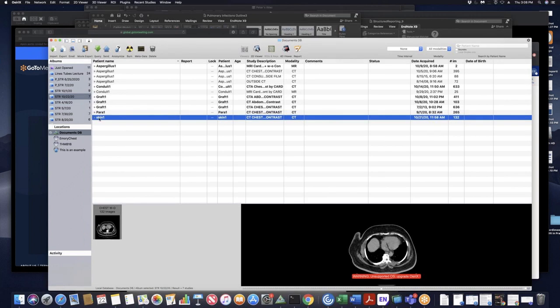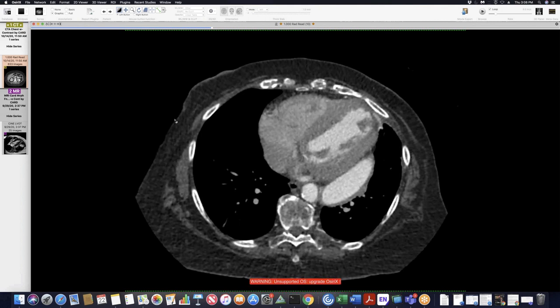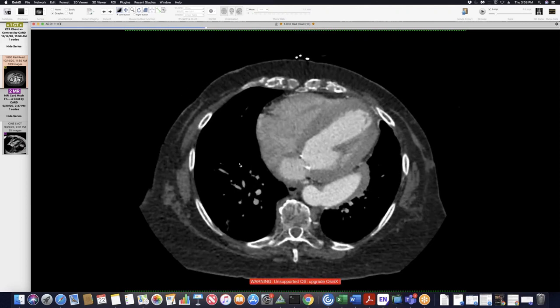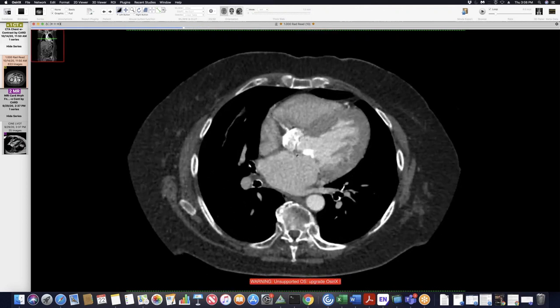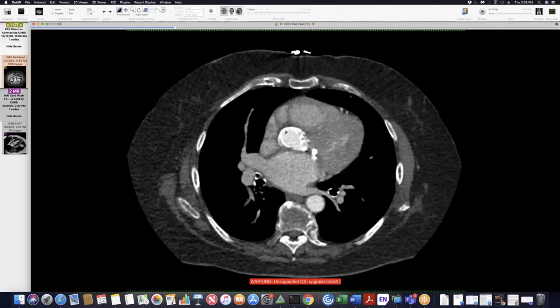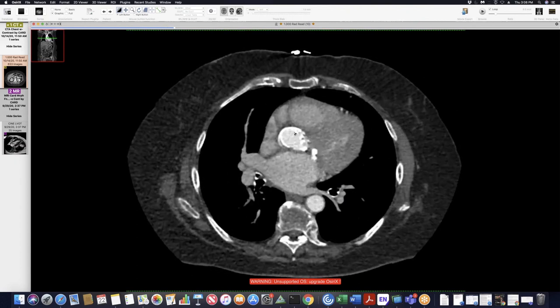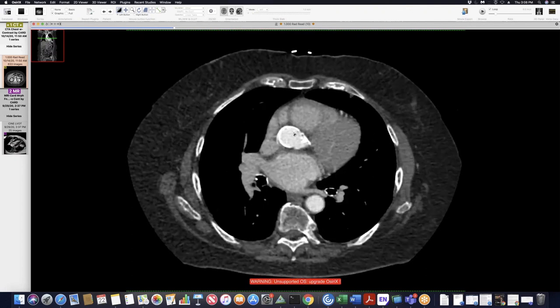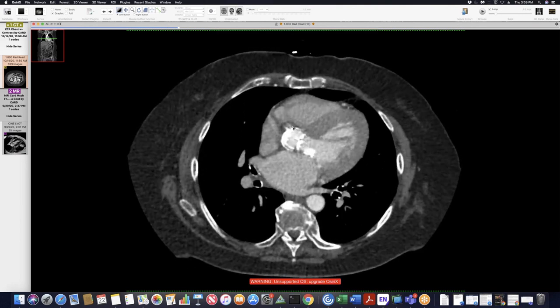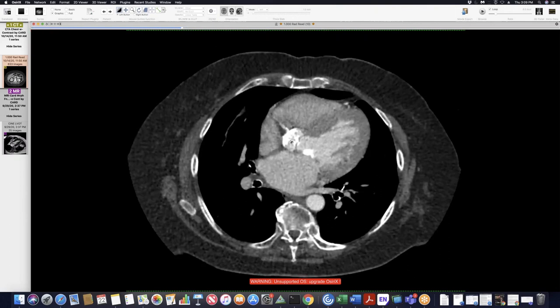This was something I've never seen before. One of my residents showed us this case. So this patient has very severe aortic stenosis, and here's his aortic valve, very calcified. He has basically very severe calcification of his ascending aorta, so porcelain ascending aorta. And so patients with this amount of calcification of their ascending aortas and valves are poor surgical candidates for valve replacement. So he had a really high gradient across the valve.